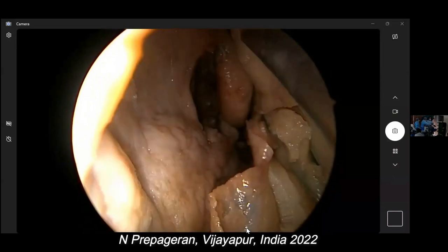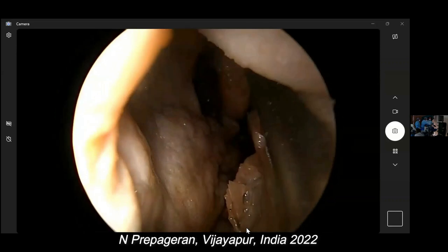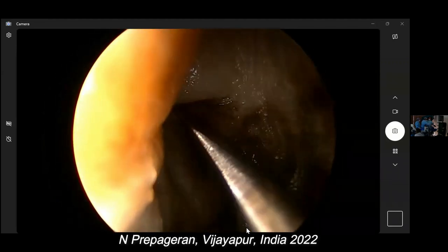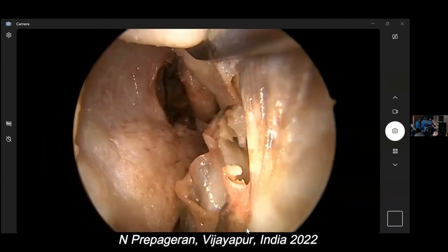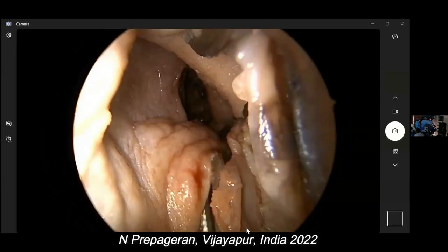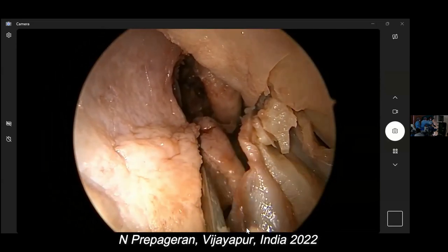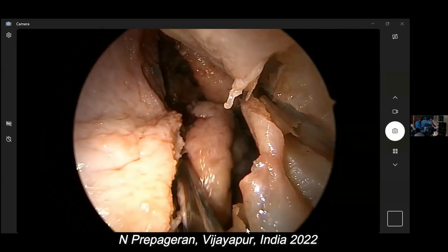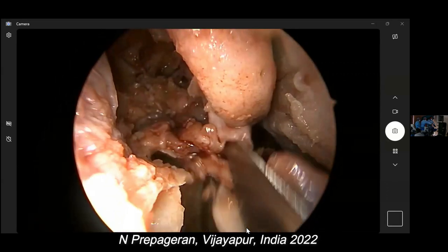Sir, can we go between the middle turbinate and the septum to open the sphenoid sinus? Can, but I want to do the coronal cut first before I go to the sagittal cut. The problem we have is the previous rhinoplasty, so this might not be a good video for us to upload to YouTube. So let me do the coronal plane first, then I'll do the sagittal plane. I won't take long for the coronal plane, don't worry.